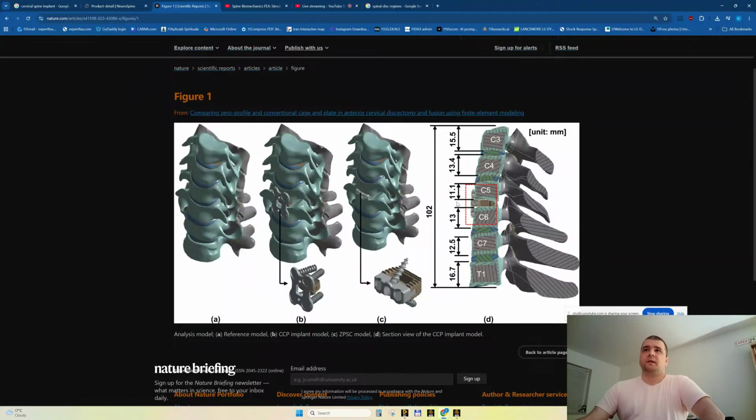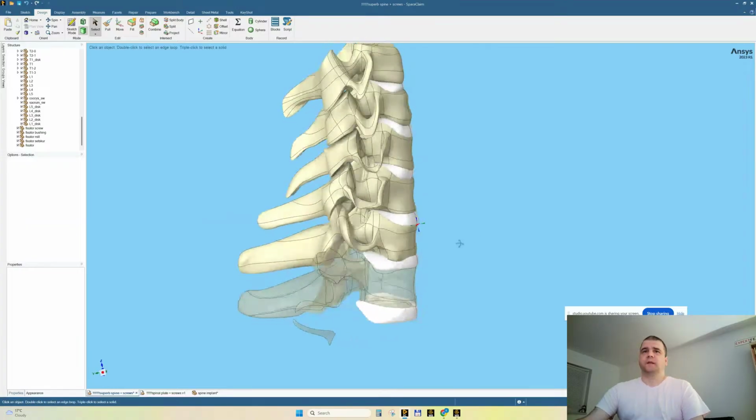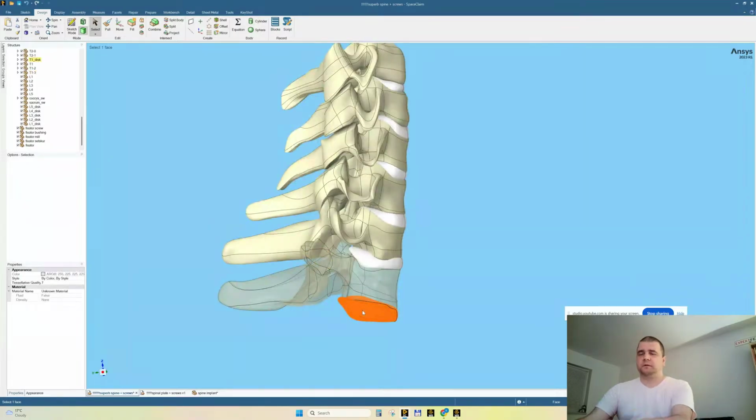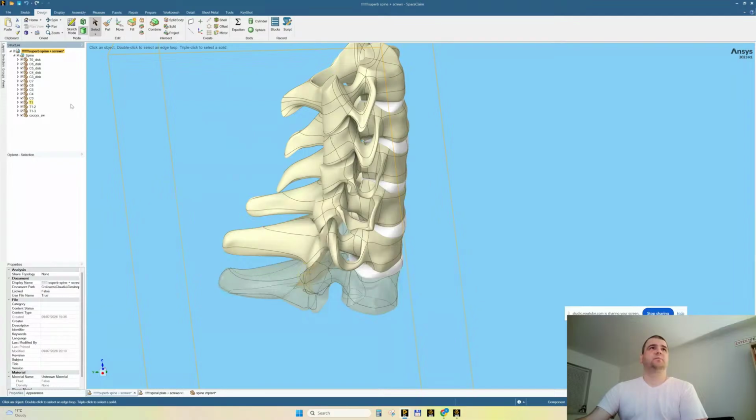Okay, so we can see, for example, that the height is 102, 10 centimeters, yes, 100 millimeters, because I'd like also to measure this height in my SpaceClaim. Firstly, we do have some artifacts from a different part, which we do not care about, because some parts were deleted. What we're doing now is right-click, delete empty components. So we stay with what we have.